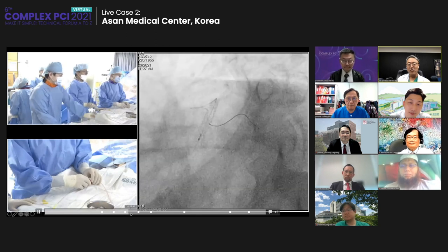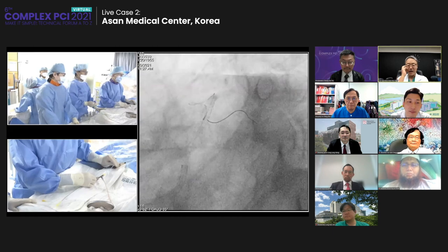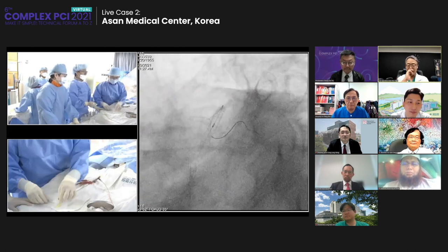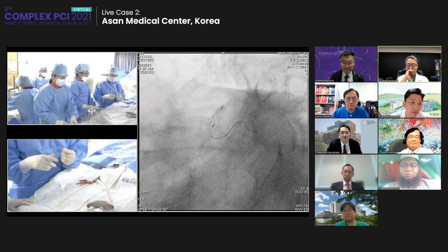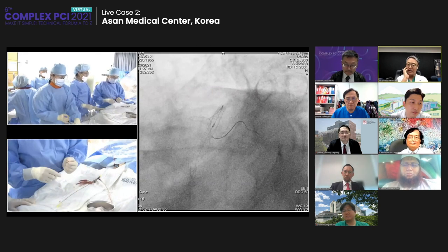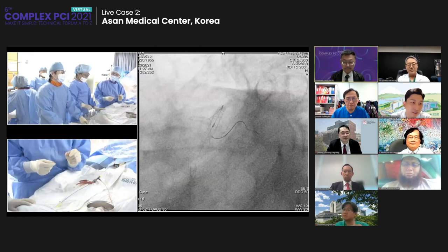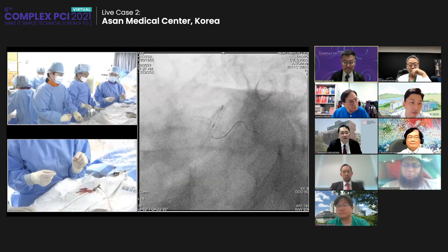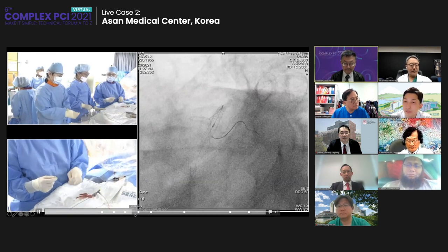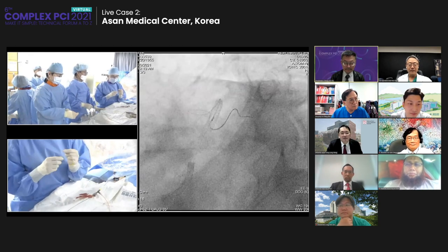This is a dual lumen microcatheter, and then try the second wire. This is what would be the difference. This is a Sasuke catheter. This is a newer one and has a smaller profile, so it can cross smaller caliber vessels and more tortuous regions. A little bit better in the complex.